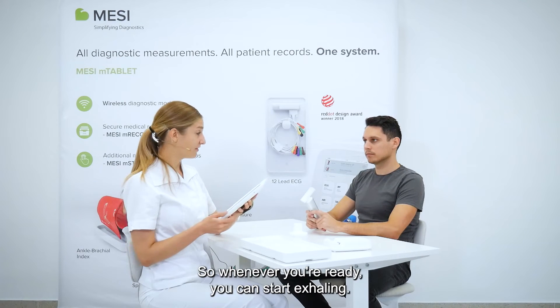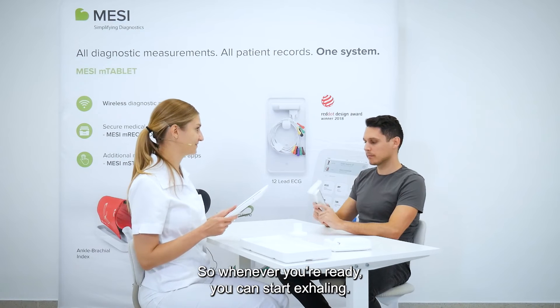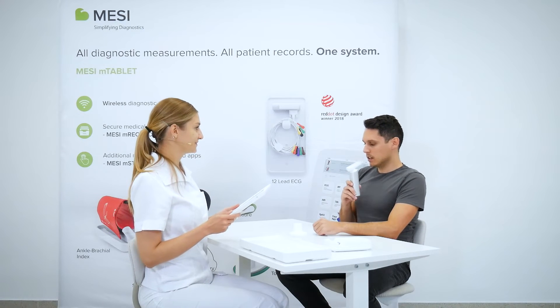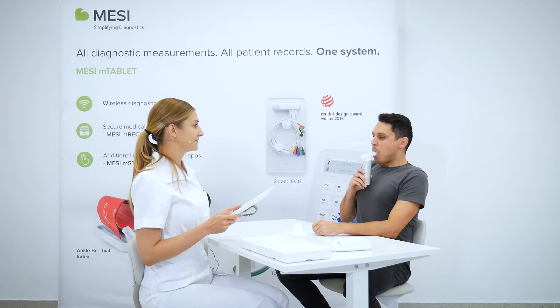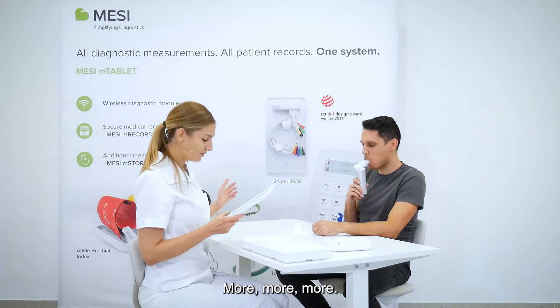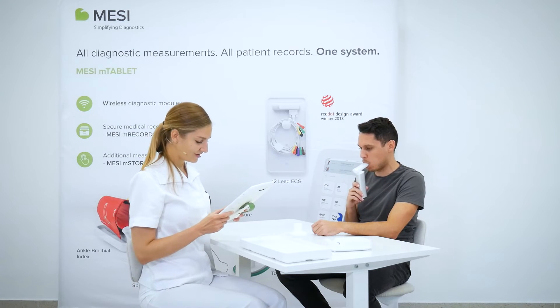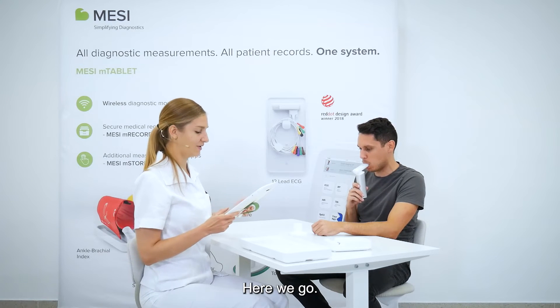Whenever you are ready, you can start exhaling. More, more, more — keep going. And here we go.